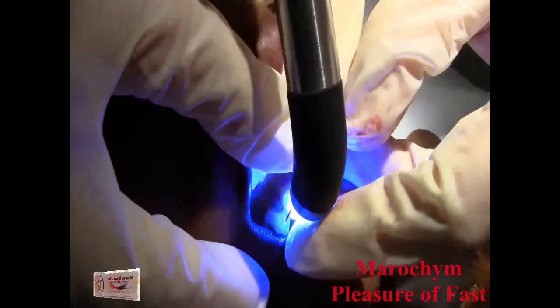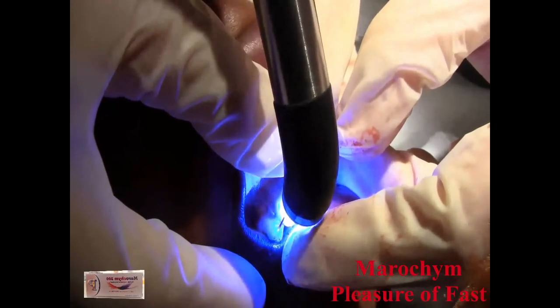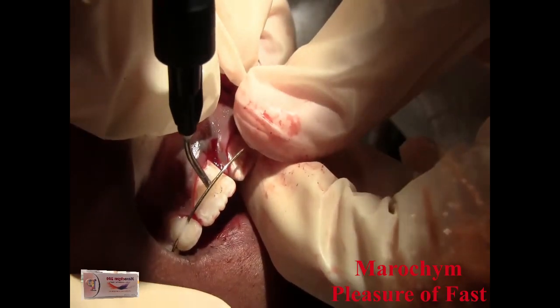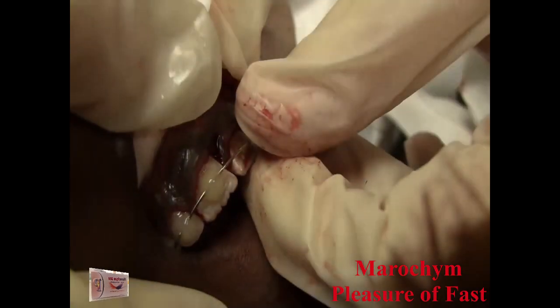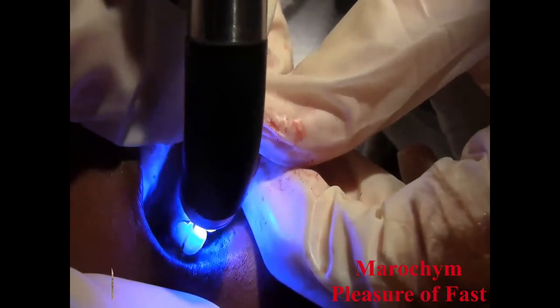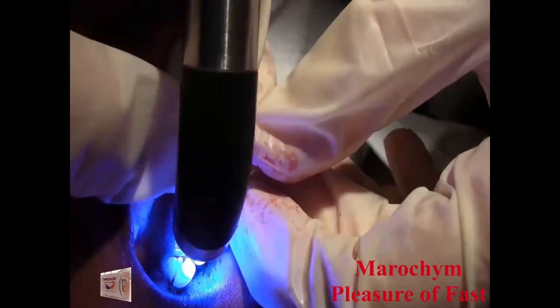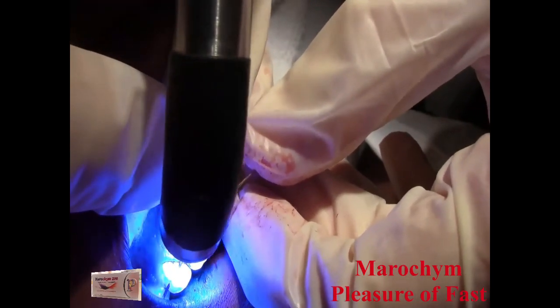So this is composite that we're using, and usually cure at about 30 seconds each. Good thing she didn't knock any out. That's good.